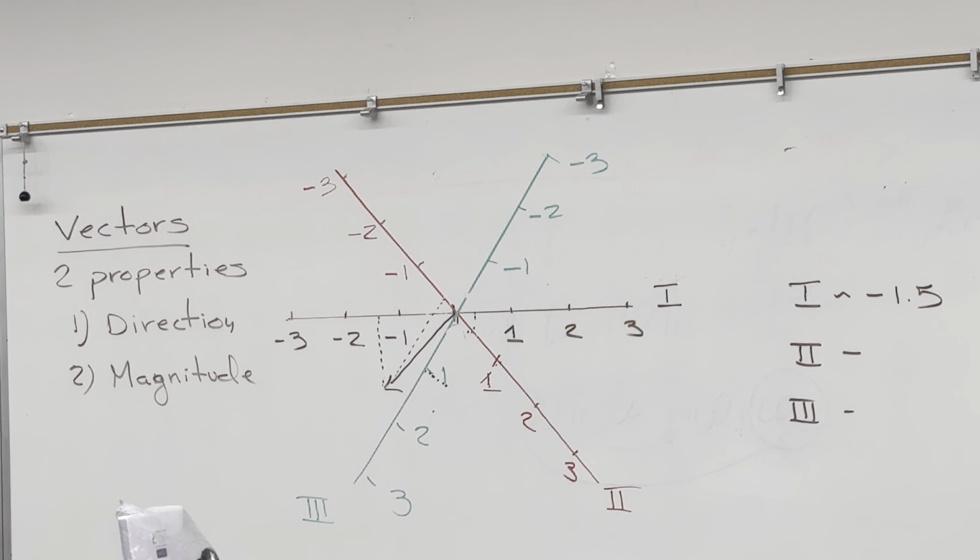Lead 1. Red electrode, left arm, left wrist. Black electrode, the right wrist. The green electrode, that's your ground, goes on the medial border of the tibia. That's lead 1.